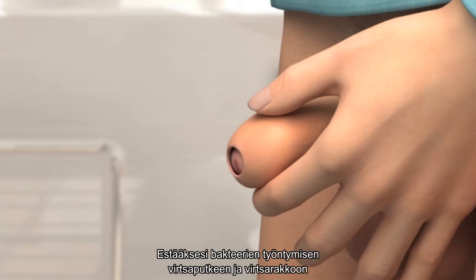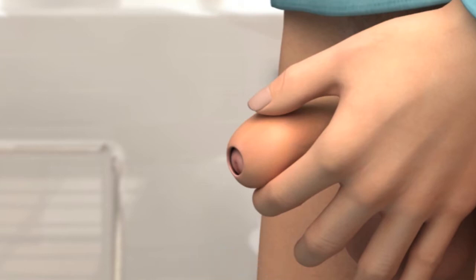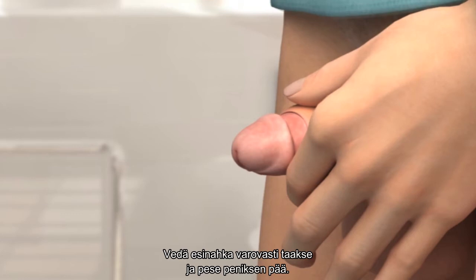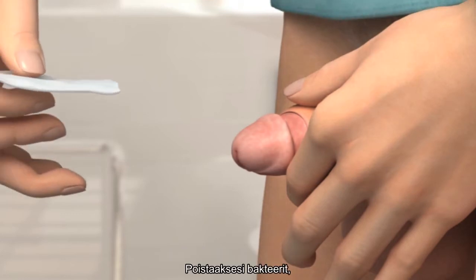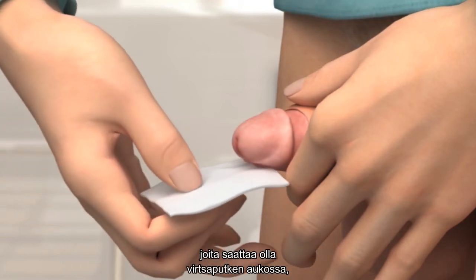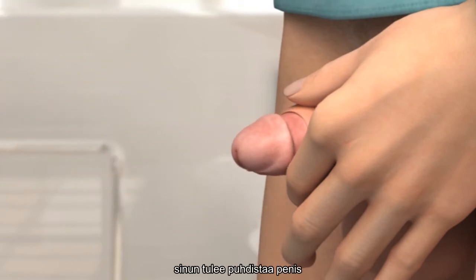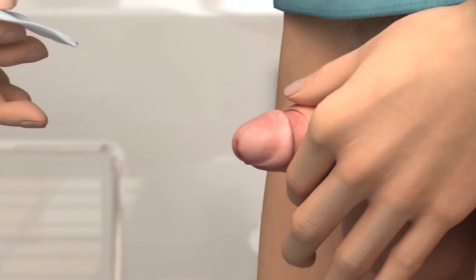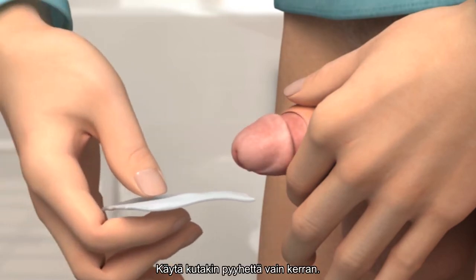To prevent pushing bacteria into the urethra and bladder, you must first clean the head of your penis properly. Gently pull the foreskin back and wash the head of the penis. To remove any bacteria that might be present at the opening of the urethra, you should clean your penis starting at the urethra and working outward. Use each wipe only once.